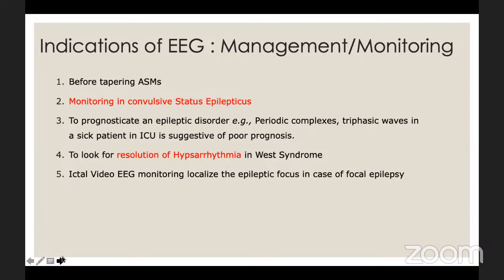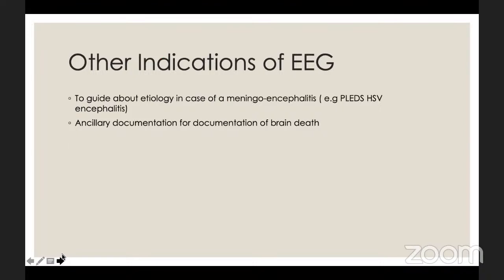Then, of course, ictal video EEG monitoring to localize the epileptic focus in case of focal epilepsy. What are certain other indications to guide about etiology in a case of meningoencephalitis? So if you find PLEDs in a case of herpes encephalitis, and ancillary documentation for brain death.